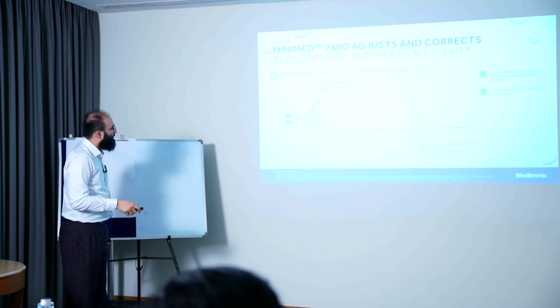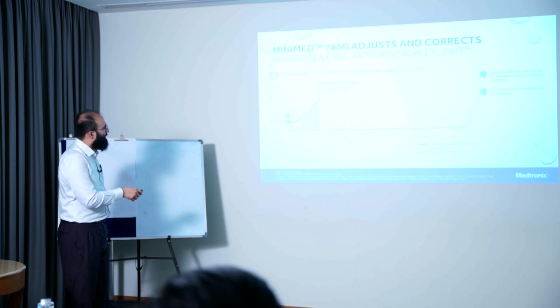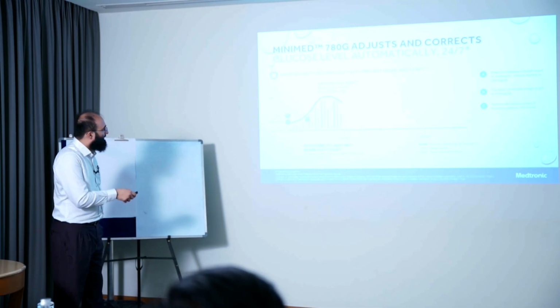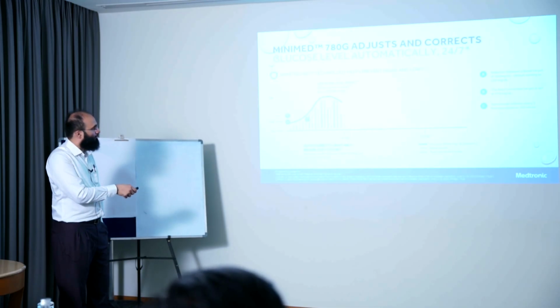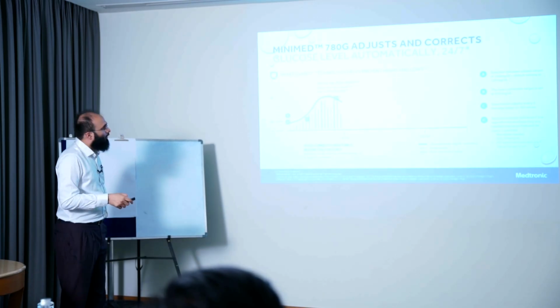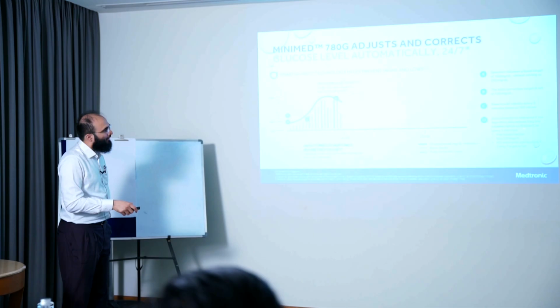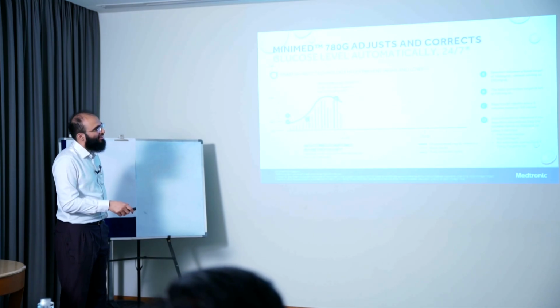So this is glucose level, this one. This is basal insulin. Right. Now sugar is at 170 and it started giving auto corrections. The blue lines are auto correction boluses. Green is basal. Auto correction is delivered if the algorithm determined that it is needed, and it can be as frequent as every 5 minutes.